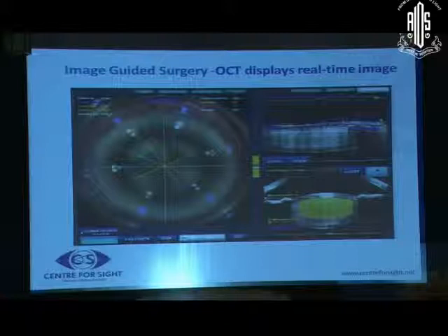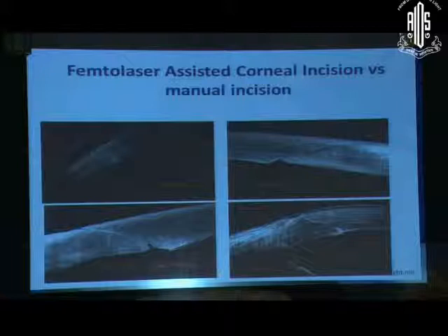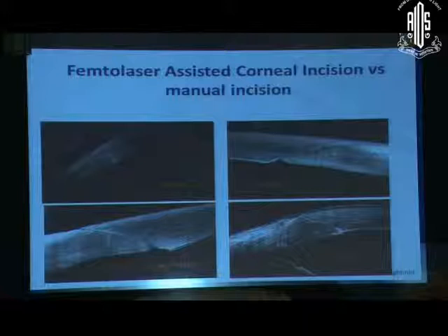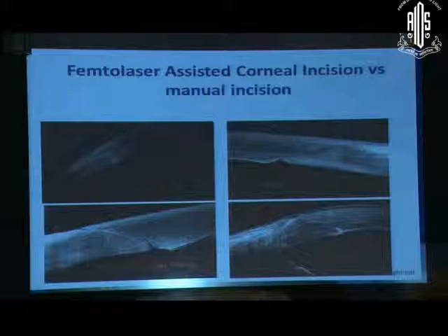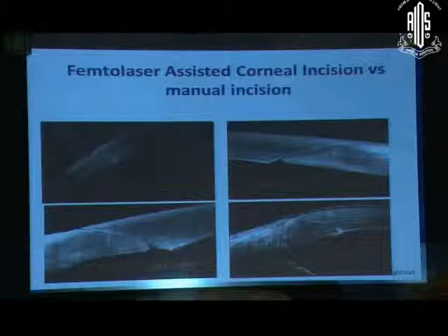You can also see the morphology of corneal incisions made post-surgery. This is an incision made with a femtolaser, which is bi-planar. This is a manual incision made with a manual keratome, which is uni-planar, and there is endothelial misalignment. This scan also shows a small Descemet's membrane detachment. DM detachments can also be managed properly using anterior segment OCT scans.